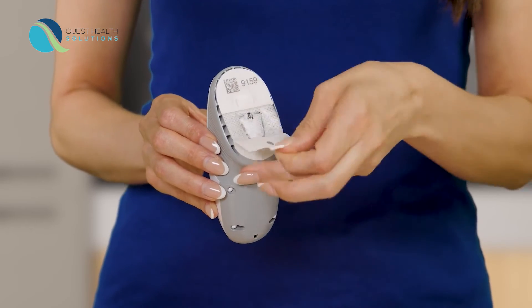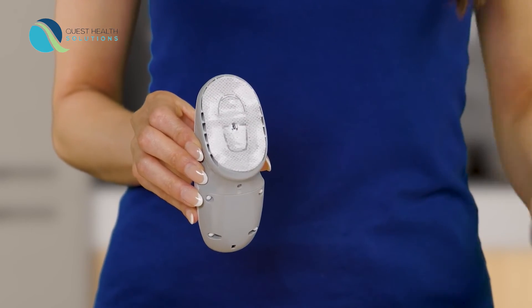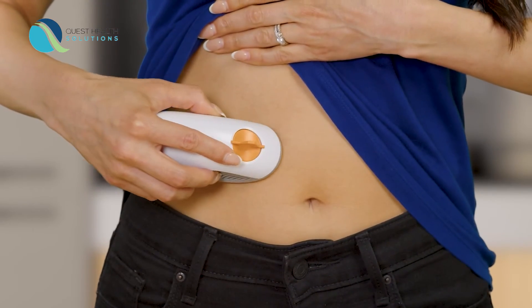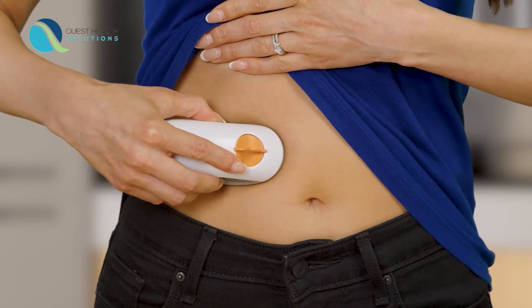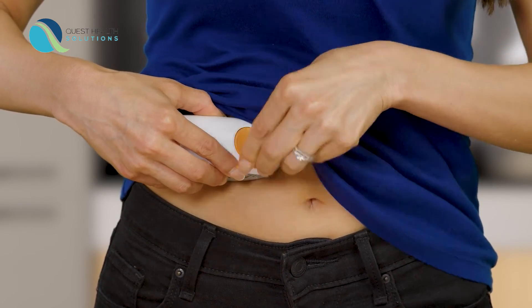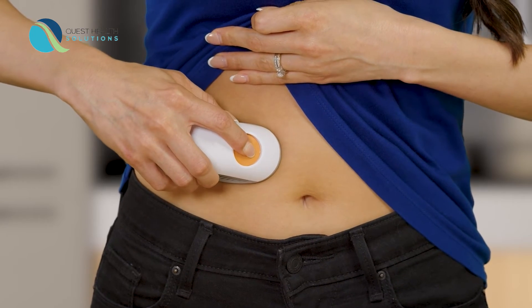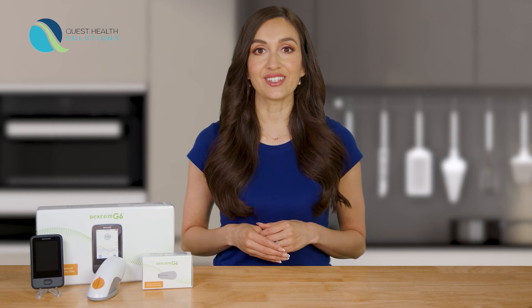Grab the sensor you used during setup and remove both labels. Do not touch adhesive. Place the applicator on skin. Remove the safety guard. Fold and break it off. Press the button to insert sensor. Remove the applicator. You successfully inserted the sensor.